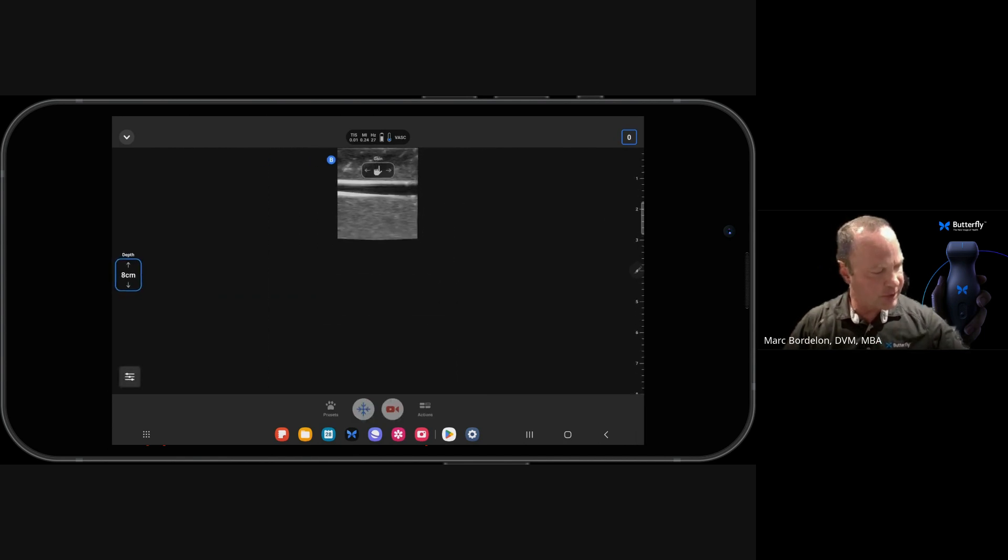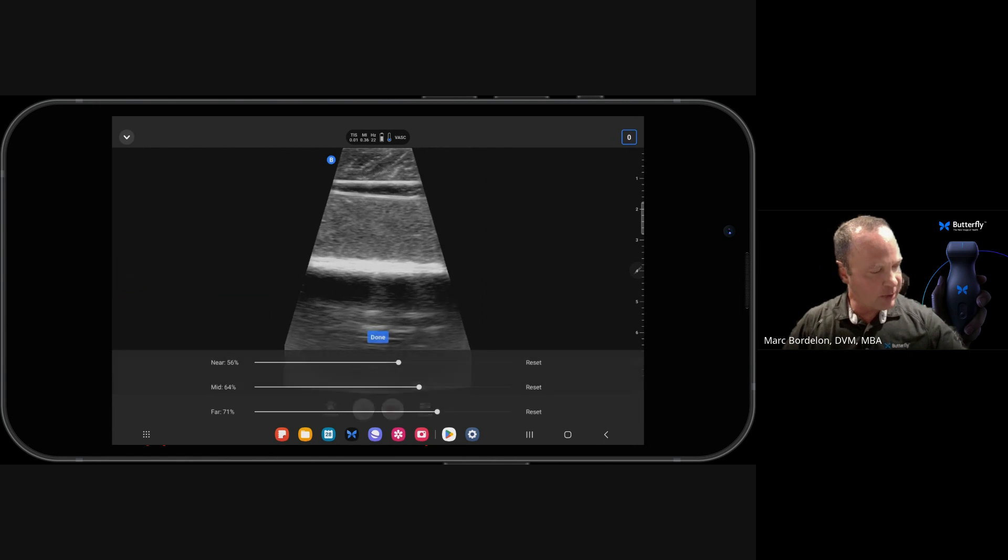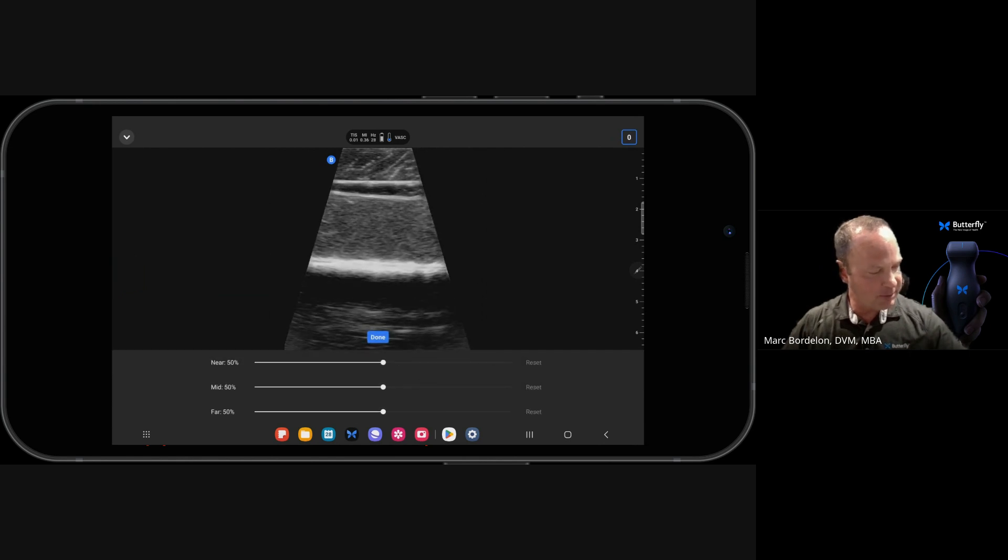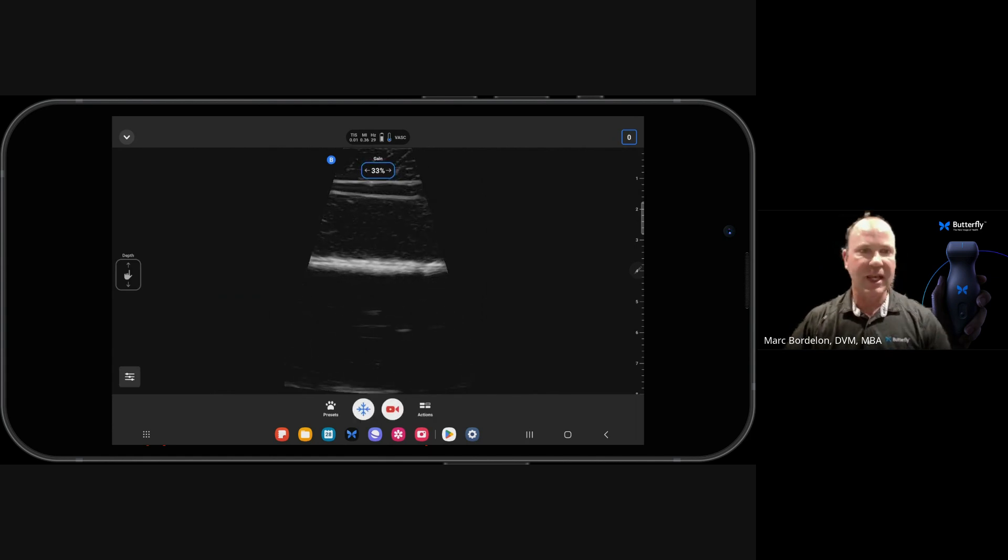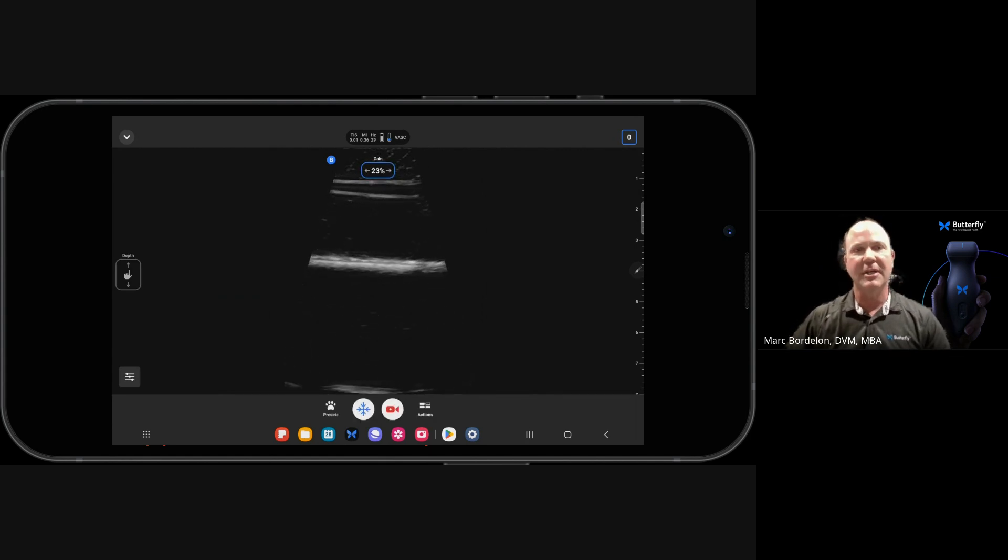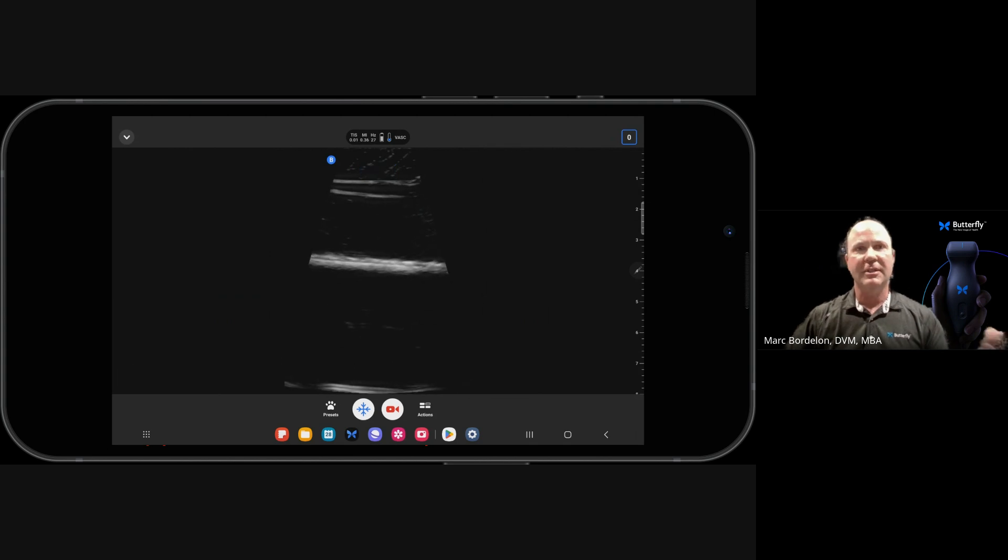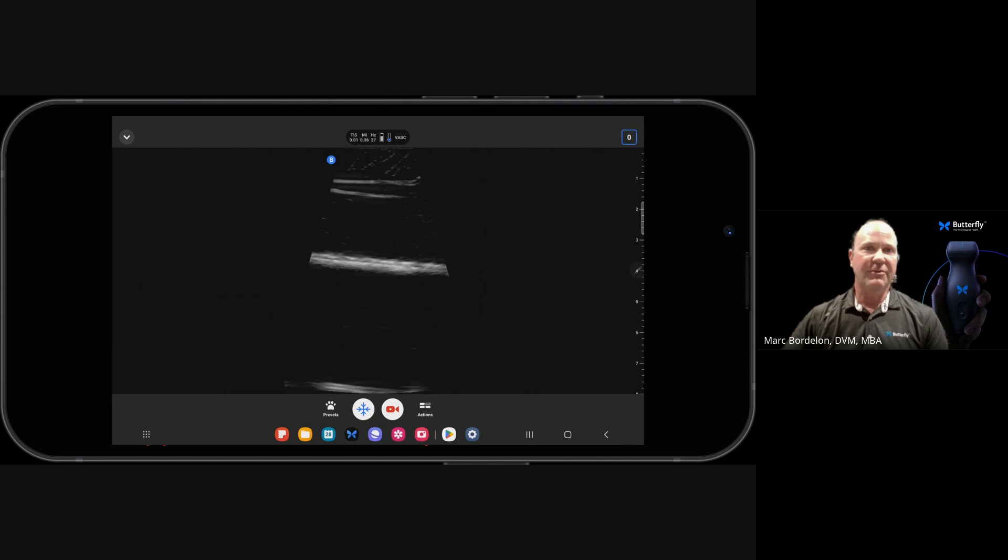So what I'm going to do is distort this image by increasing the depth, resetting my time gain compensation controls, and adjusting the gain. And we can see this is just not an optimized picture. So the really simple steps on how to optimize a picture are going to be four steps.